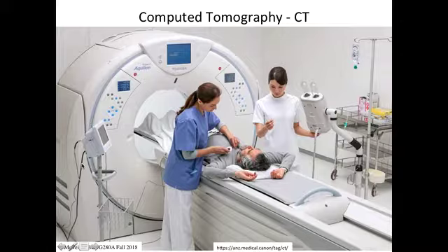So this is what a modern CT scanner looks like. It is essentially a cylinder, right, with a hole cut out of the middle, so it looks like a donut. And this hole is about anywhere from 75 to 100 centimeters in diameter. So it actually has a fairly large opening. It's not a claustrophobic experience going into a CT scanner because it's pretty short. It's about 80 centimeters long. And so unless you're having your head scanned, your head is usually outside of the scanner when your pelvis or your heart or something else is being scanned.